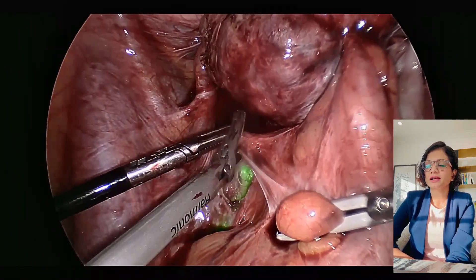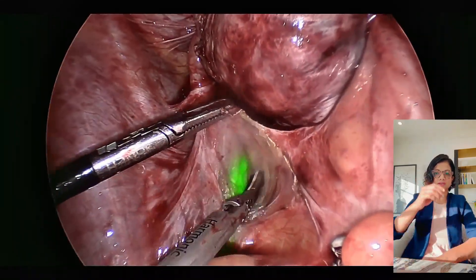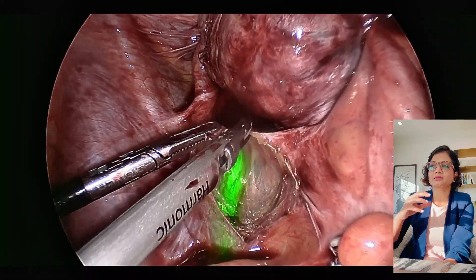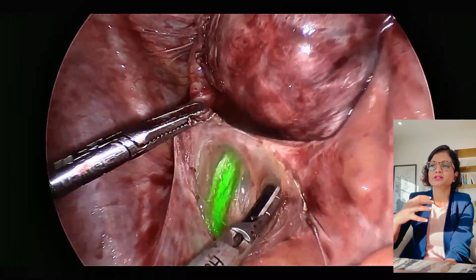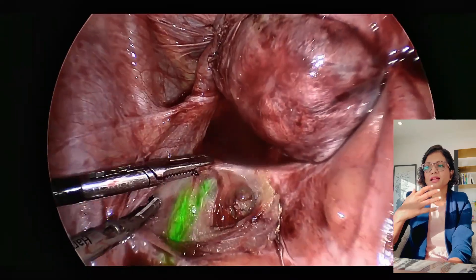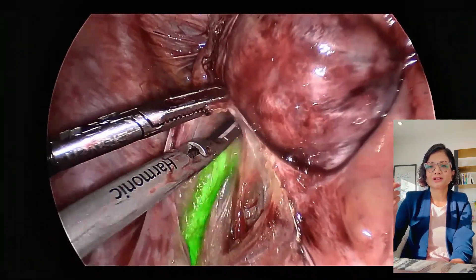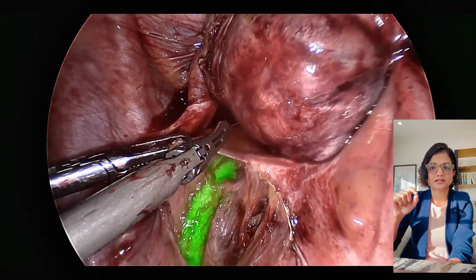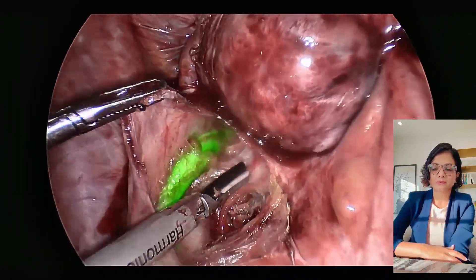This is stage 4 endo which had bowel involved as well, and the sigmoid and the rectum had been adhered to the back of the uterus or the uterine torus. Like I mentioned in my previous video, this is a continuation from that only because I wanted to show how ICG differs with robotic as well as laparoscopy.